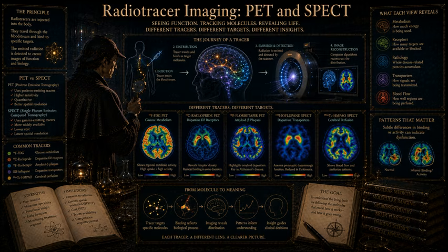Exactly. Because of this, every new radiotracer must undergo rigorous internal dosimetry calculations before it ever touches a human. We have to figure out exactly where the radiation goes. The absorbed dose of radiation is physically measured in grays, which represents joules of energy deposited per kilogram of biological tissue. But because different tissues react differently, we weight that measurement to calculate the biologically effective dose, which is expressed in sieverts. The textbook spends a lot of time on the concept of the critical organ.